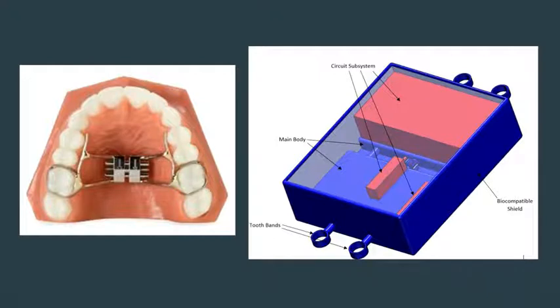The device can be in the patient's mouth sometimes up to 6 months or longer, so it is important that the device is able to last this entire time period. And with that said, I will now talk a little bit more about the mechanical housing subsystem.